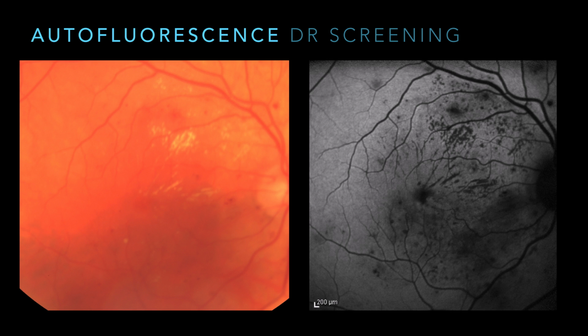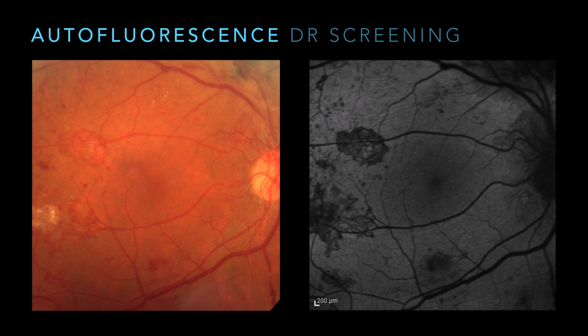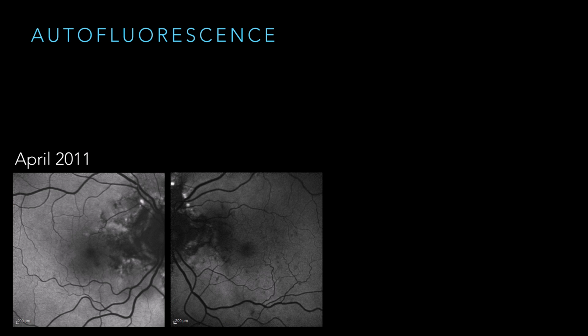If you were to get wide-field Optos autofluorescence on all your diabetic screening patients and they didn't have any blockage, you could probably say with some confidence they don't have hard exudates, they don't have dot blot hemorrhages. If you got OCT, you could also say they don't have diabetic macular edema. You could basically become a radiologist and take care of all your diabetic screening, which is what we've been trying to do in the military for like 2 years, and I don't know if it'll ever happen. Again, this is PDR, it's very obvious on the color, it's super obvious on the autofluorescence.